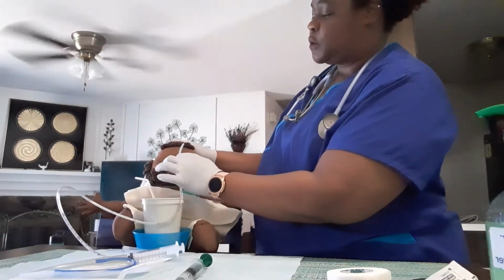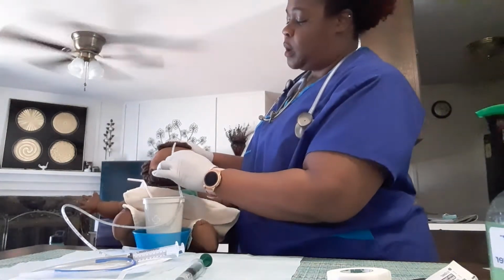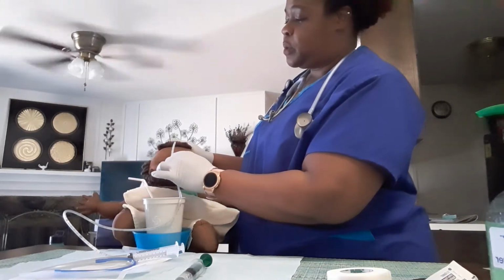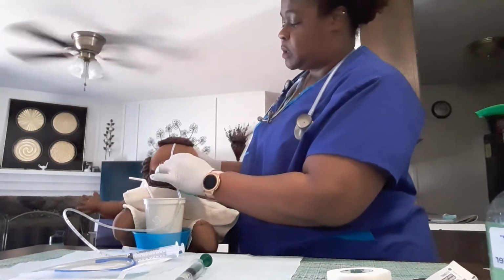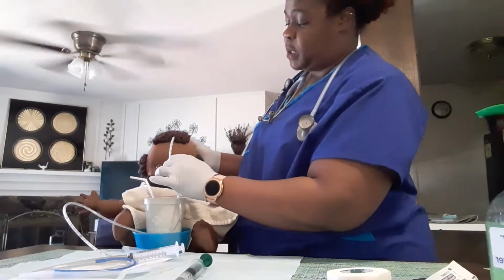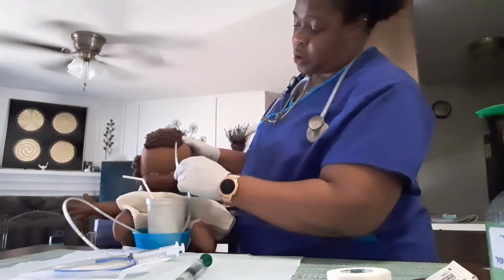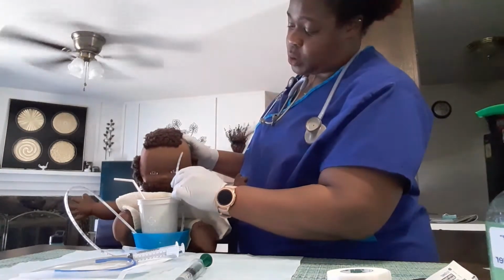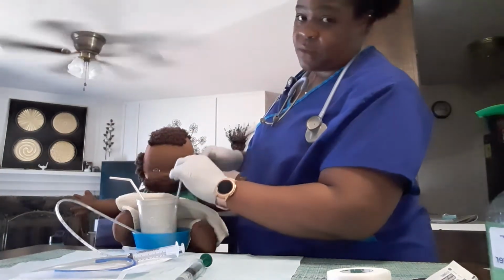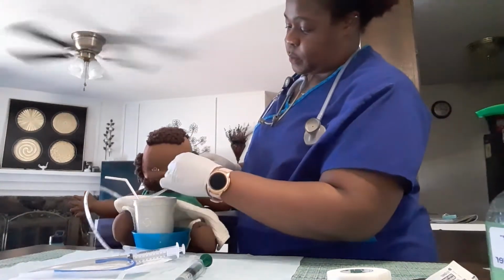Once I'm in those first 4 inches or so, I'm going to stop and give the patient a chance to catch their breath. I ask them if they're okay, because this is going to be the point where it's the most uncomfortable, but we're going to get over the hump. So I'm going to have the patient tuck their chin and start taking sips of water. With each sip of water, I'm going to advance. So it will be sip, advance, sip, advance, sip, advance.